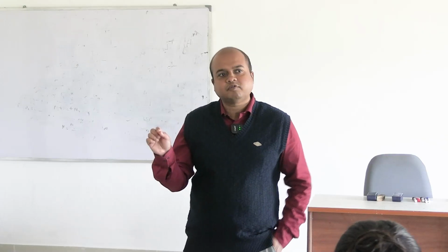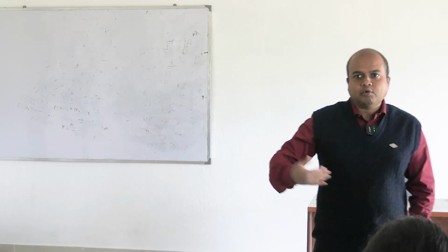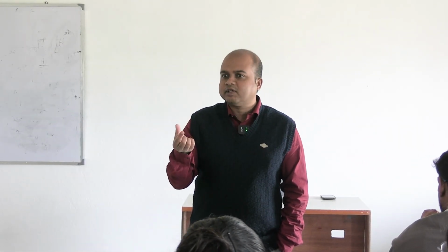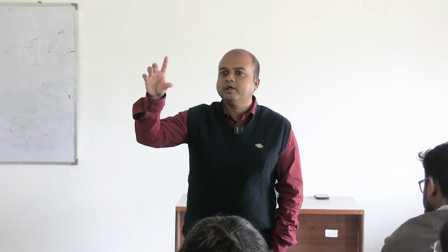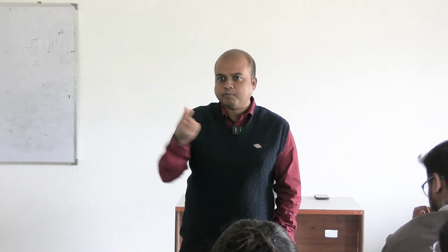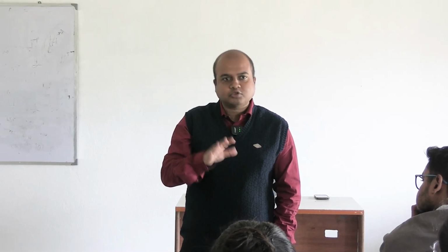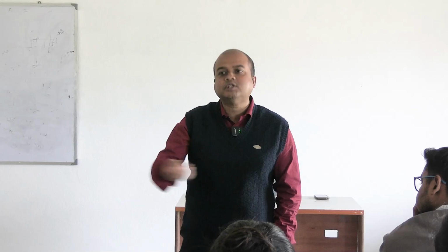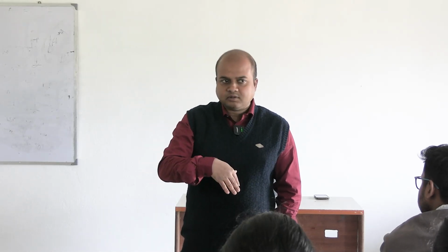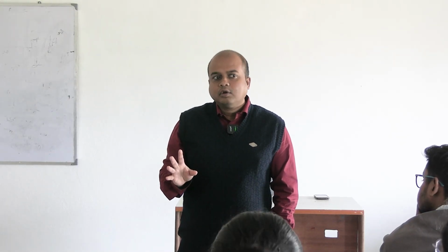But at least the size of the bulb when we compare the two pipettes. And obviously, after knowing the whole theoretical portion about how to charge, calculation and all, if the size of the bulb is not larger, how will the bulb and that small upper part of the stem hold 100 times blood, 100 times of any fluid? It may not, if we charge the pipette with water. So the volume of that part is 100 times the lower part. But in case of WBC pipette, it is only 10 times.